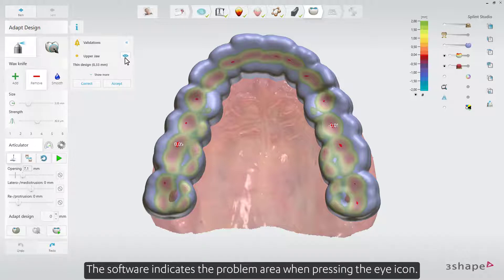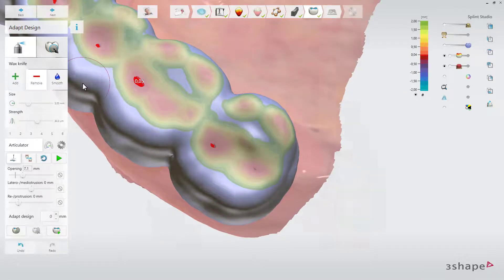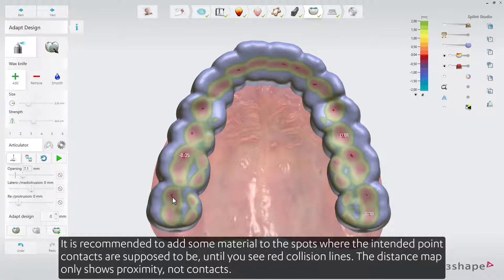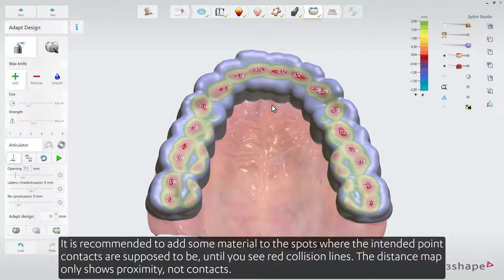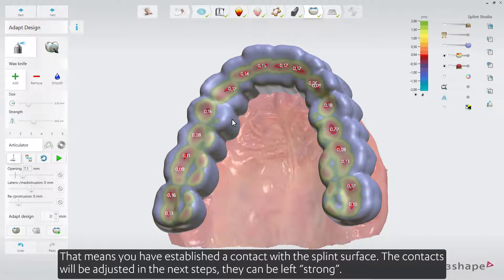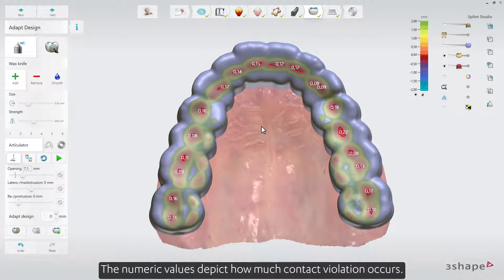The software indicates the problem area when pressing the eye icon. By enabling the distance map, you can see where potential contacts will emerge. It is recommended to add some material to the spots where the intended point contacts are supposed to be, until you see red collision lines. The distance map only shows proximity, not contacts — that means you have established a contact with the splint surface. The contacts will be adjusted in the next steps and can be left strong. The numeric value depicts how much contact violation occurs.